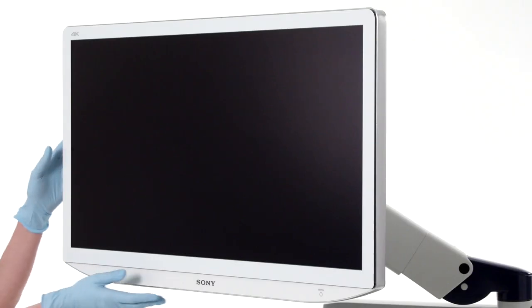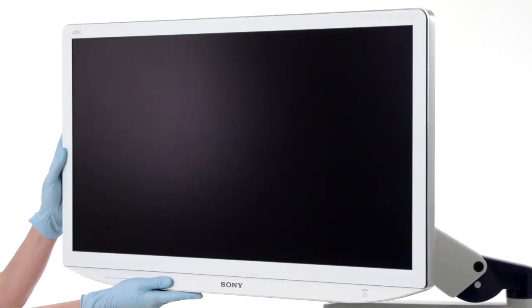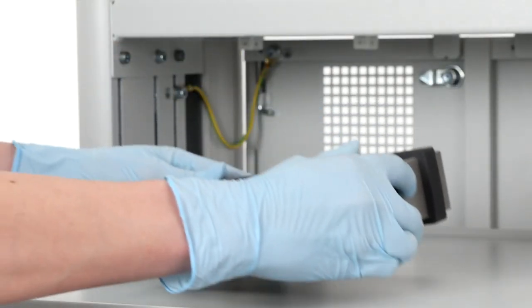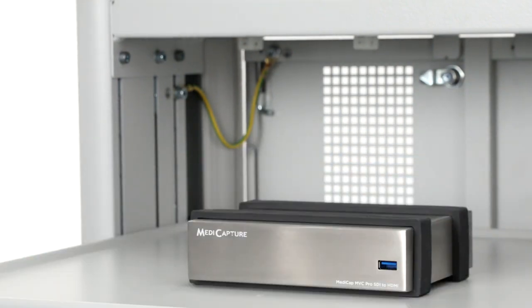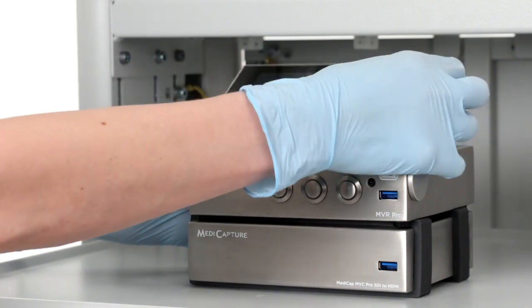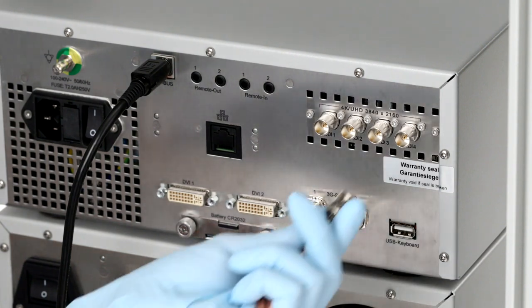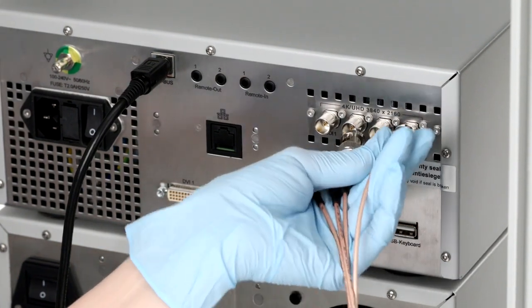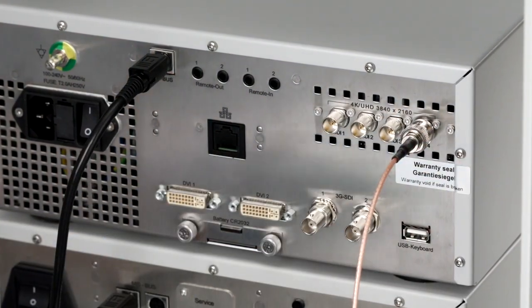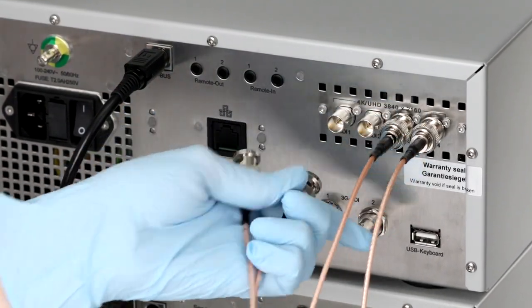Lastly, adjust the physical orientation of the monitor as necessary for optimal viewing for your surgical team. If you are planning to record videos and capture images in 4K, add the MetaCapture device and the converter box to the cart. If you are recording video or capturing still images in HD resolution, connect your camera control unit to the MVR Pro using an SDI HDMI cable, which is included in the MVR Pro packaging.